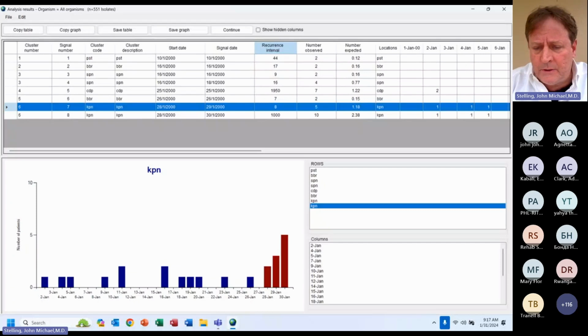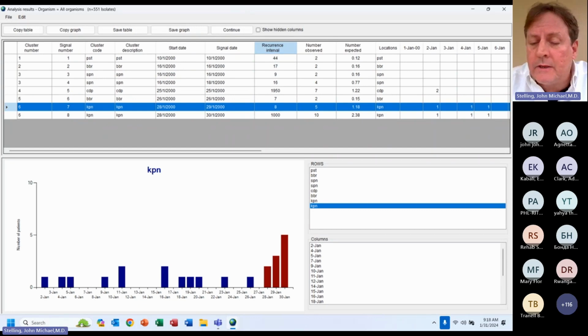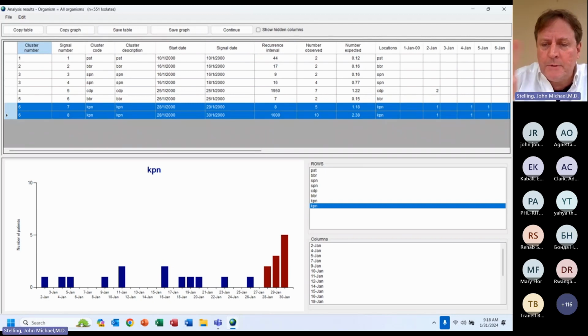But then when it gets up to January 30th, this is what's really significant. I put the threshold very low just to highlight this point. Simulated perspective, it found this cluster on the 29th. And that's this graph. And it found it again on the 30th. So this is what I mean by the evolution. It found it Monday with 5 people. It found it Wednesday with 10 people. So you're seeing the distribution over time. So here I see row 6, cluster number 6 appears twice because it was detected twice because the cluster grew.